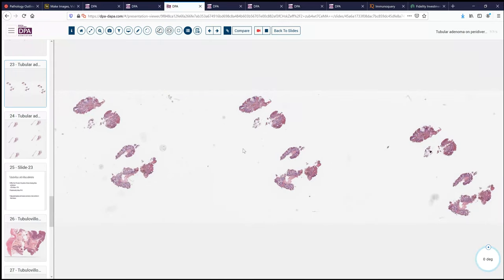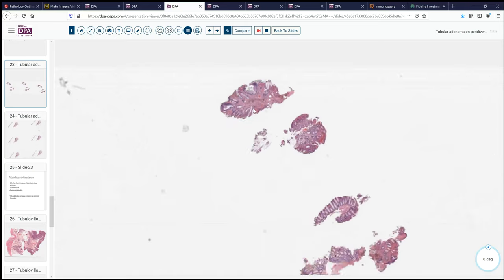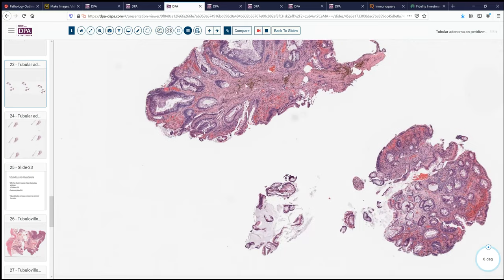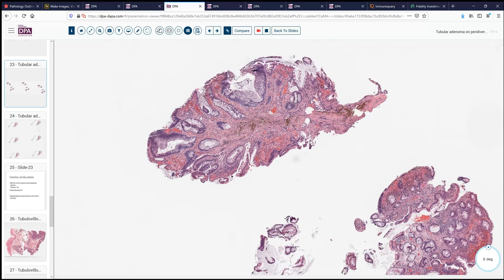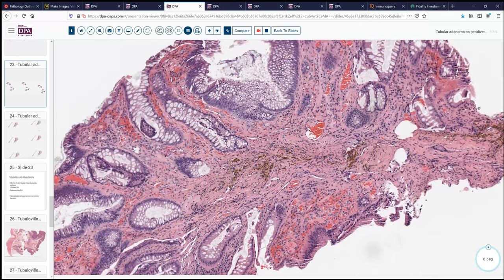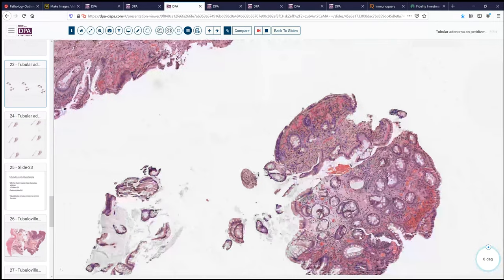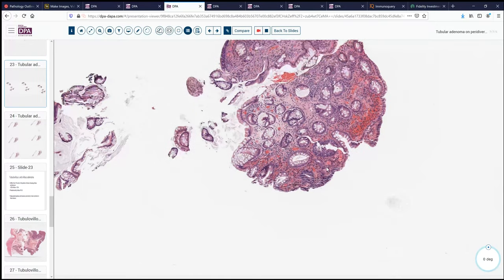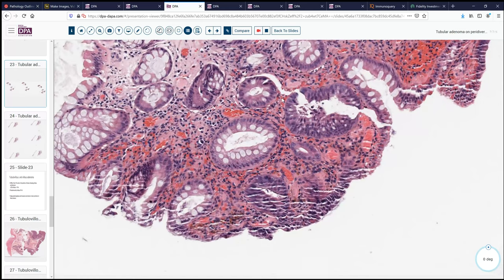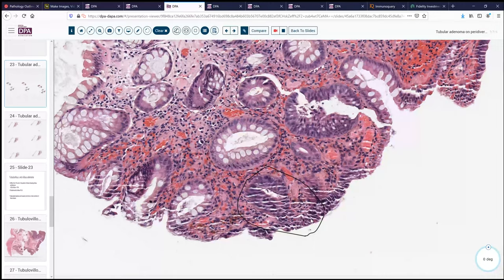Here's another case. We can see there's some abnormal glandular tissue with a little different color to this epithelium, some stromal hemosiderin, and an enlarged distorted gland. There's mucin retained here, but again there is stratification of these cells. Looking at these other fragments, we can see right here a slightly different gland — see how it stands out next to the normal glands? Now, the shatter artifact I mentioned — notice how these glands have this cracking, shattering artifact, whereas the one right next to it has less of that. This is the brittleness of these cells that can sometimes be useful in identifying these lesions.